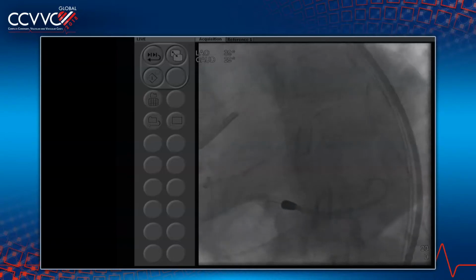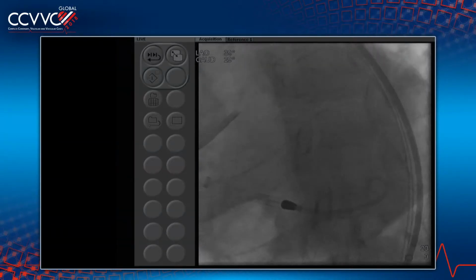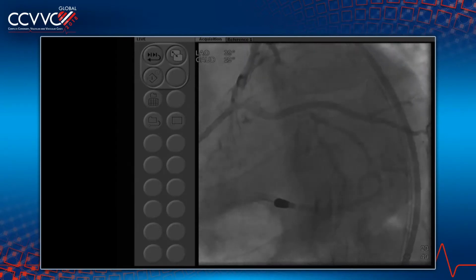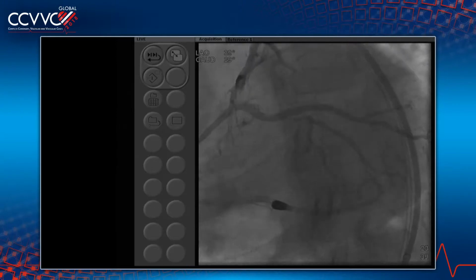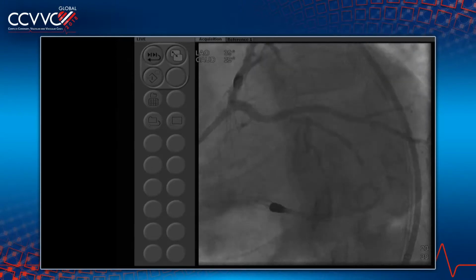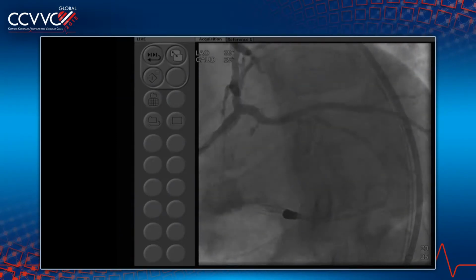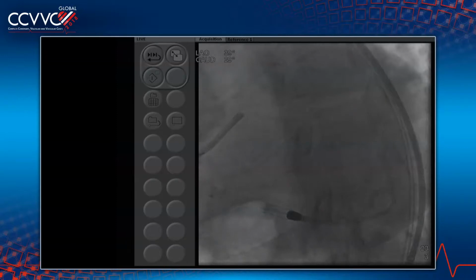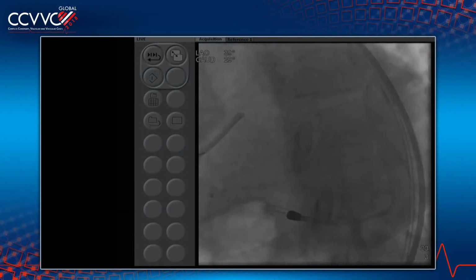So we don't have the MRI, as you rightly pointed out. Viability MRI has become the gold standard, particularly when surgeons are taking these patients, they want to make sure that the tissue, the myocardium, is viable before they take it. In this particular case, we didn't go to that level. But again, as I said, the patient is very symptomatic and has a positive wall motion abnormality. So with that note, Anu has a plan now. What do you want to do now, AK?